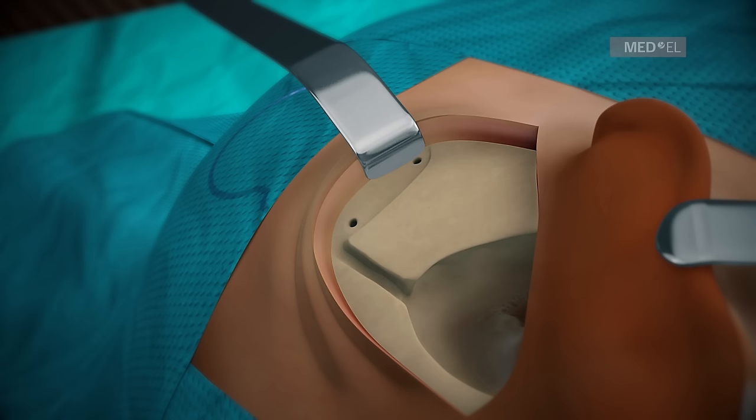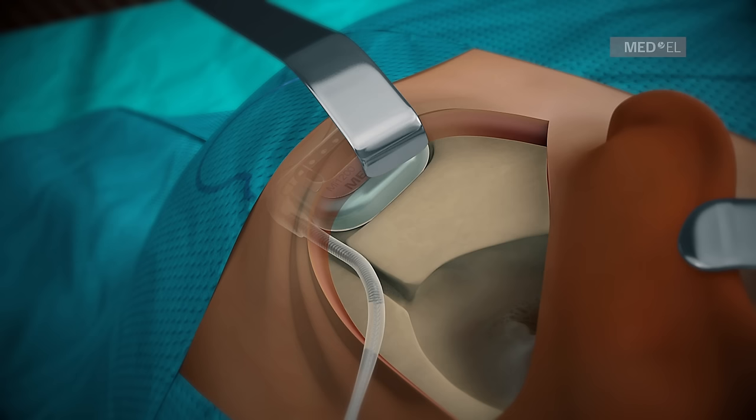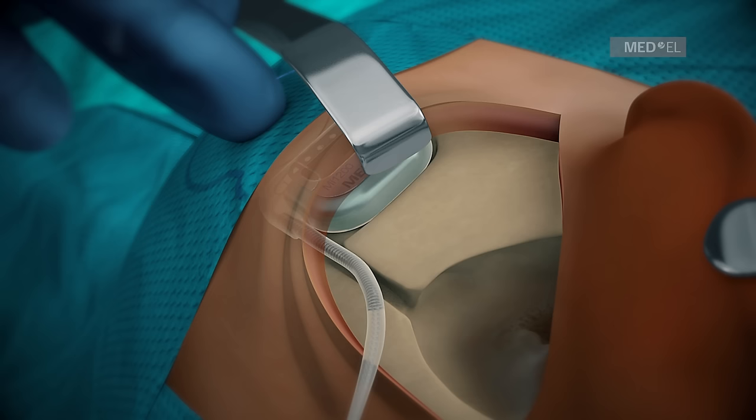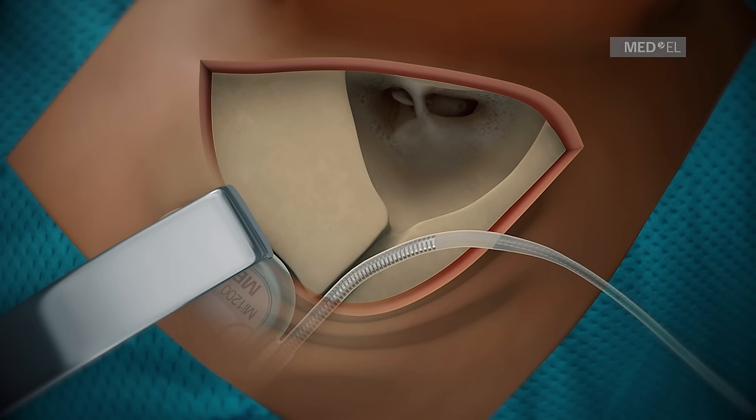Step 4: Implant Placement and Electrode Insertion. After the round window or cochleostomy site has been prepared, insert the implant under the skin and align the two pins to the pinholes. Palpate the implant through the skin to check for proper implant fixation. The pin implant, together with a tight subperiosteal pocket, will provide secure placement without any additional fixation, such as suturing.